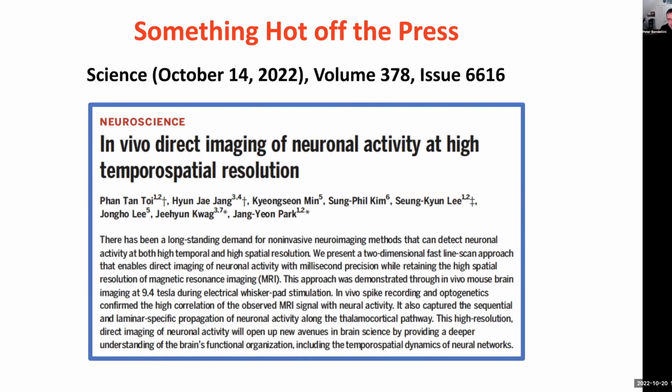Okay, the very last thing. I wanted to show this because this is sort of in line with potential controversy or a challenge. It's always been a challenge in fMRI to look at neural activity directly. My own group has tried to look at neural currents. Theoretically, if you have a current through dendrites, it should cause a phase shift. Turns out it's very, very hard, if not impossible, to see in people. This paper came out last week, and it's one of the most, if not the most, convincing papers that I've seen. And it's not looking at neural current effects.